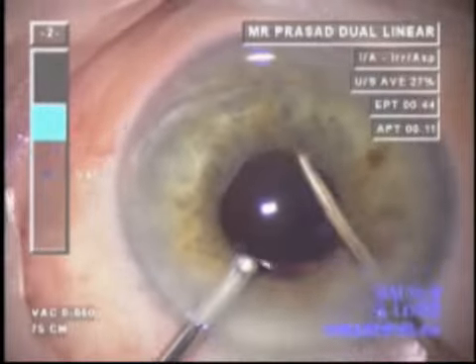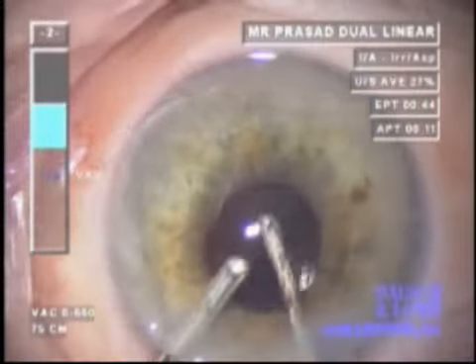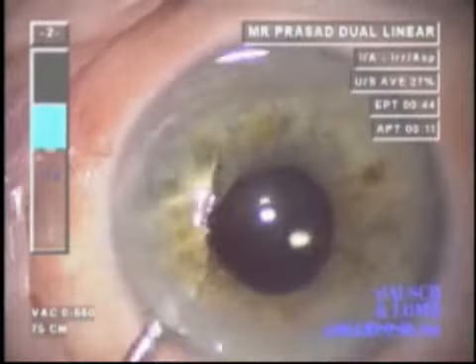The leading edge of the lens enters the capsular bag, and following removal of OVD and insertion of a small amount of cefuroxime, the case is done.